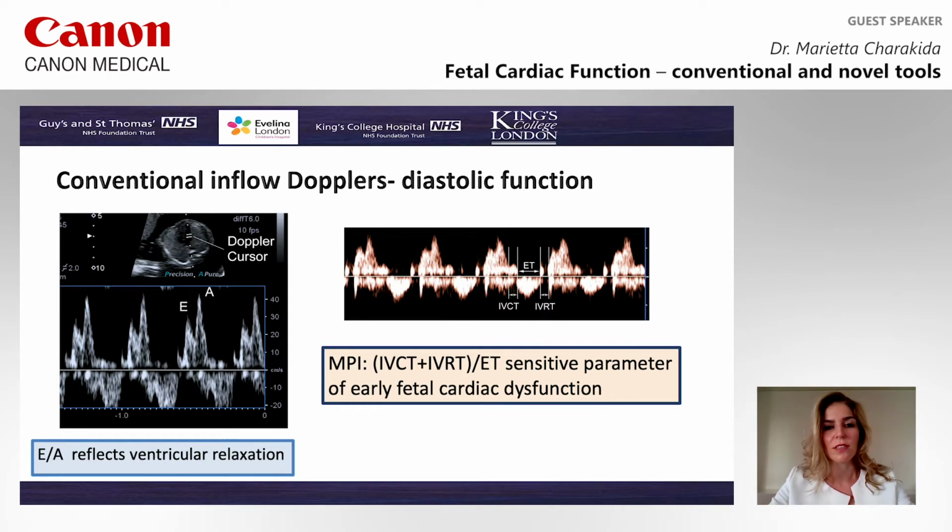fetal heart rate. We can use inflow Dopplers to estimate the timing intervals, the isovolumetric contraction and relaxation time, and we can present them independently or as part of a composite parameter, the myocardial performance index, which is a sensitive parameter of early fetal cardiac dysfunction.